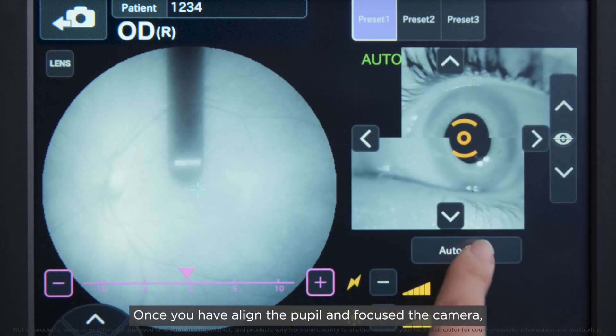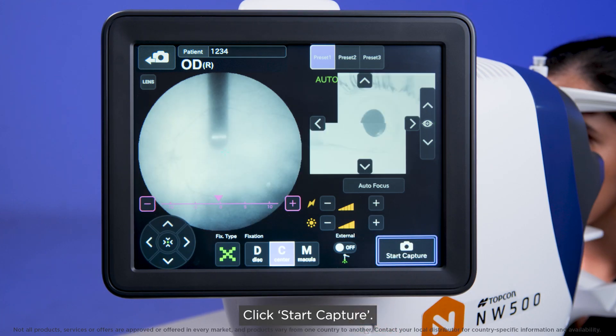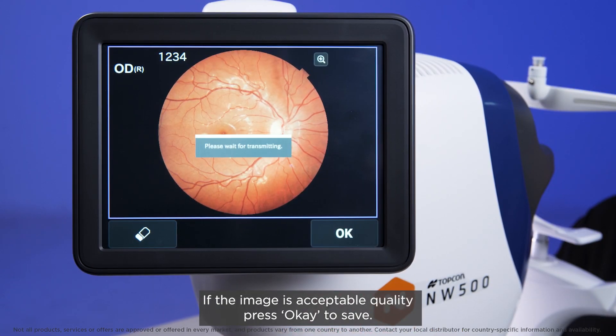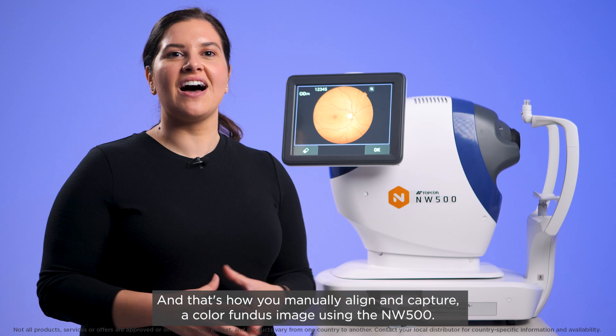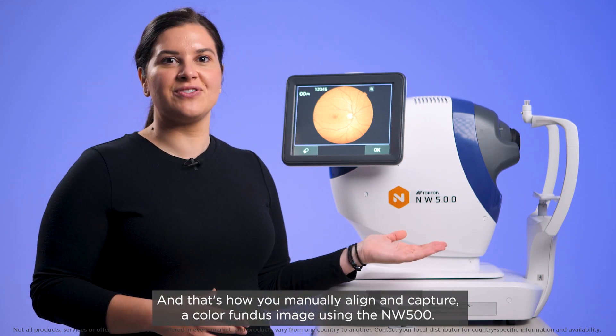Once you have aligned the pupil and focused the camera, the alignment guides turn green. Click Start Capture. If the image is acceptable quality, press OK to save. And that's how you manually align and capture a colour fundus image using the NW500.